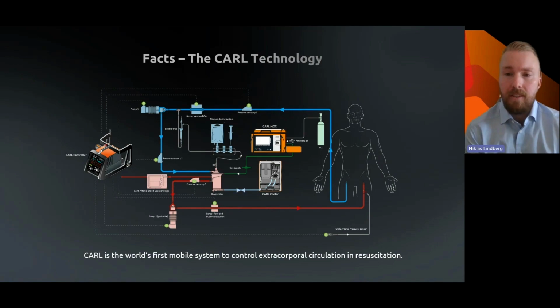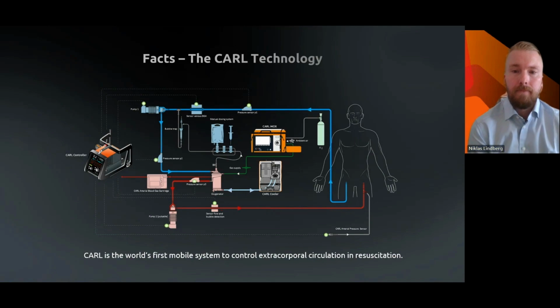And on the very distal side, shortly before the arterial cannula, you have the 45 degree angled luer connection where we can insert the fiber optic cable up to the descending aorta to measure the pressure that we are delivering to the patient.